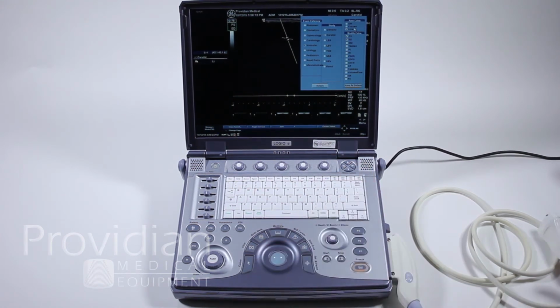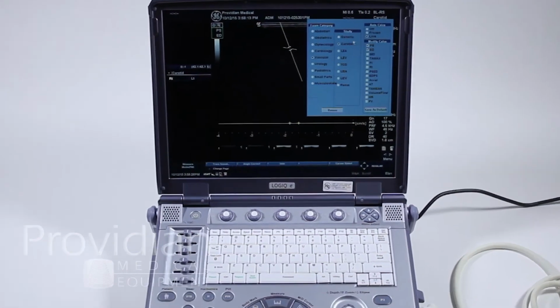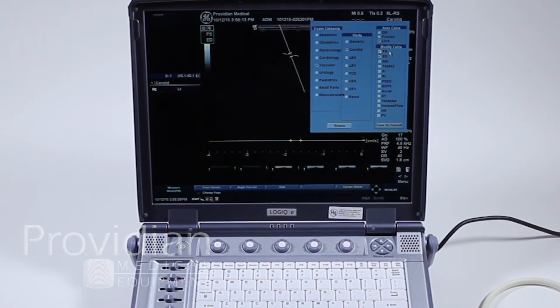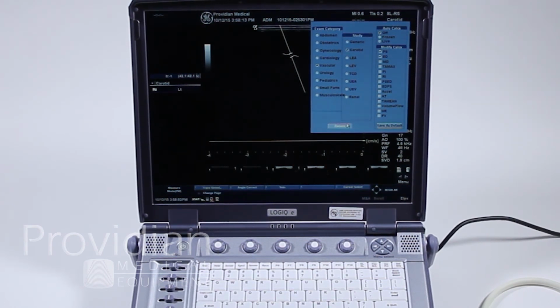Now notice that this menu has changed completely since I went to the live auto calcs. This says, okay, for my auto calcs, and I'm going to do vascular carotid, and then it's going to say, what calculations do you want to show up when you're doing the auto calcs? Right now it's peak systolic and end diastolic, but you can have all of these show up on that auto calc. Granted, that will really fill up your screen, but it is an option for you to do that. Now I'm going to turn these back off and click return.